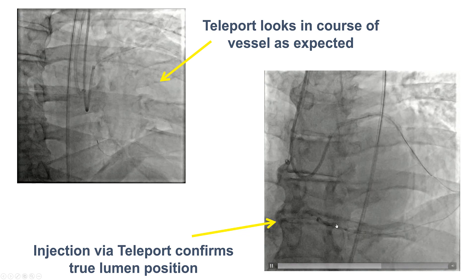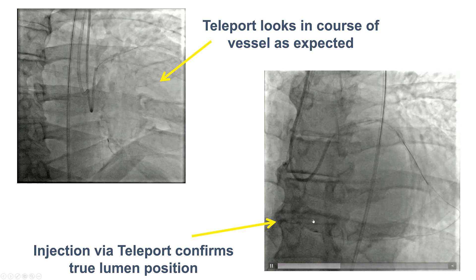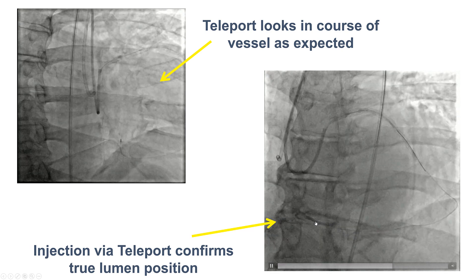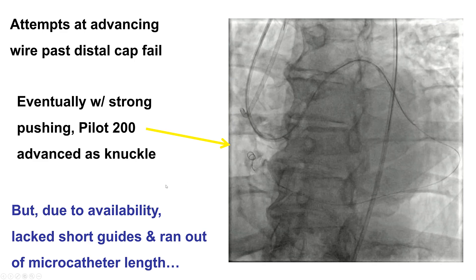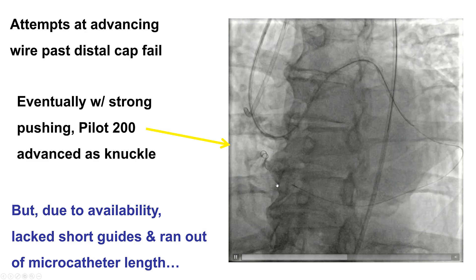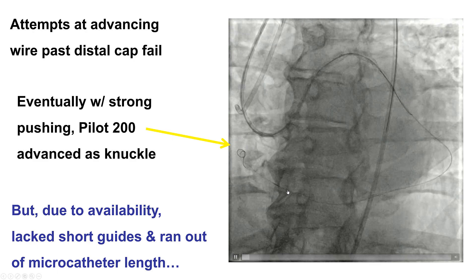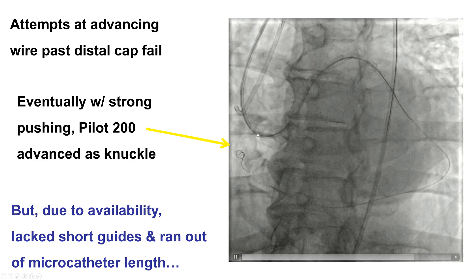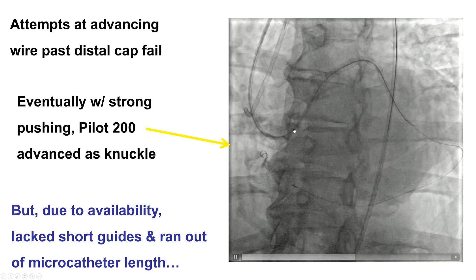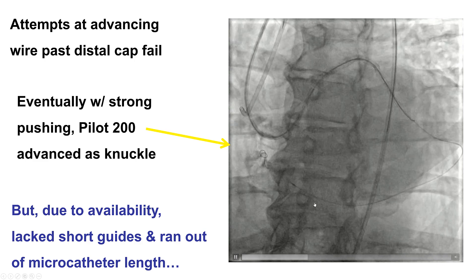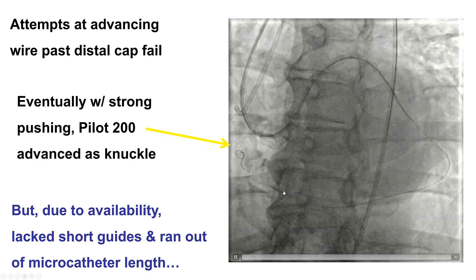We now had access to the distal true lumen. We performed an injection showing diffuse disease in the distal right coronary artery and then started to work our way backwards. We were eventually able to advance a Pilot 200 to the mid-right coronary artery. Unfortunately, because we were using the radial access and did not have 90 cm long radial guides, this was a longer guide and epicardial collateral, and we ran out of microcatheter space with the 150 cm Teleport.